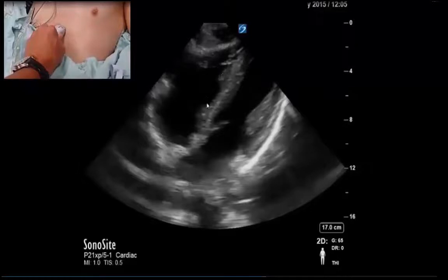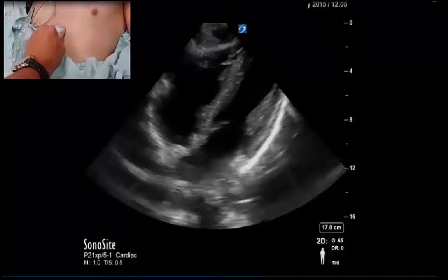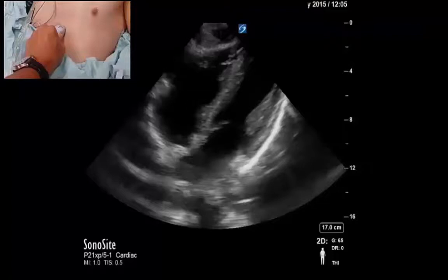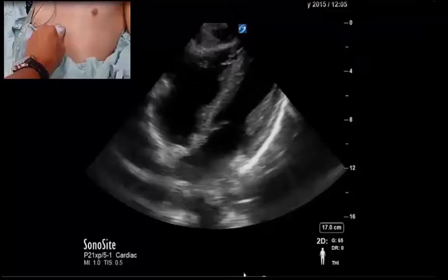One thing we often comment on is that we don't like to make conclusions from a single view. Here we may consider the RV a little bit dilated and the LV mildly to moderately depressed, but it's tough to make strong conclusions from one view. As my colleague Dr. Scott Millington likes to say, one view is merely a hypothesis — we can't make real strong conclusions from one view.